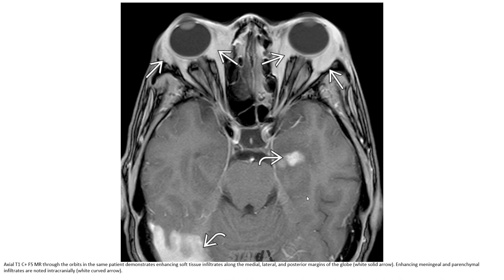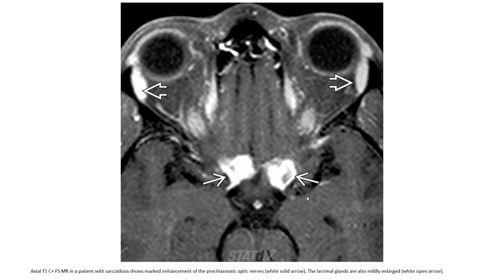Enhancing meningeal and parenchymal infiltrate nodules intracranially. And this is the Axial T1 C-plus fat-saturated MR in the patient with sarcoidosis showing marked enhancement of the pre-chiasmatic optic nerve. The lacrimal glands are also mildly enlarged.